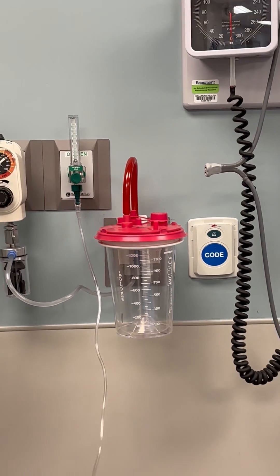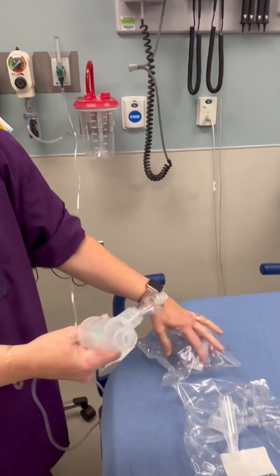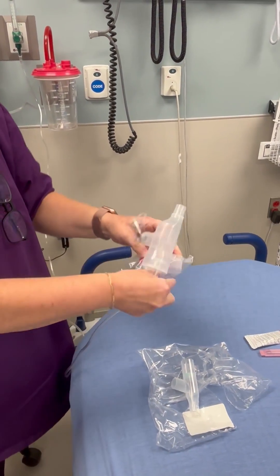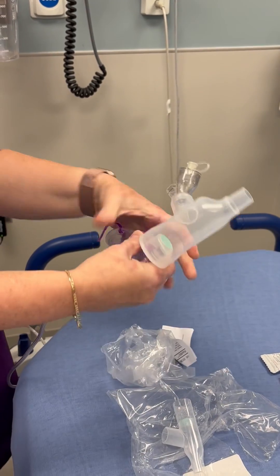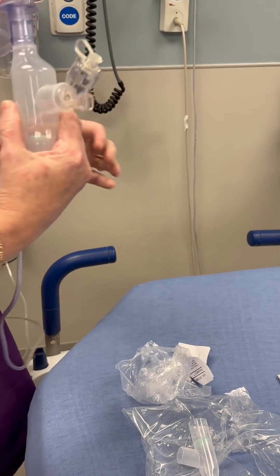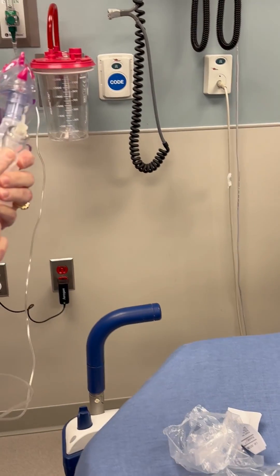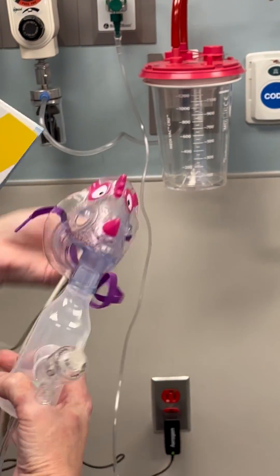So for a child with croup, we're not going to make them do the mouthpiece. We're going to take that off and we're going to give them the pediatric mask. We're just going to put that on right there like that. This is going to go on the child and face outward. Now this section right here is where you're going to get your breakup.